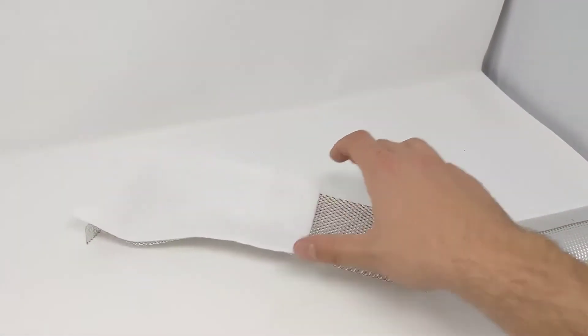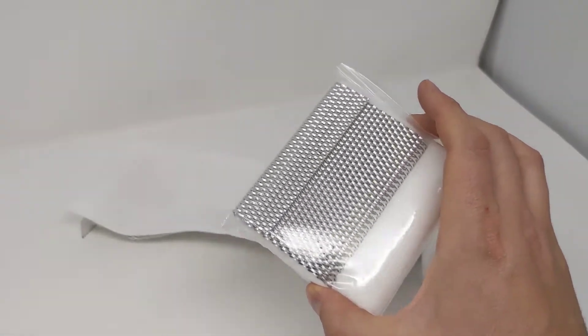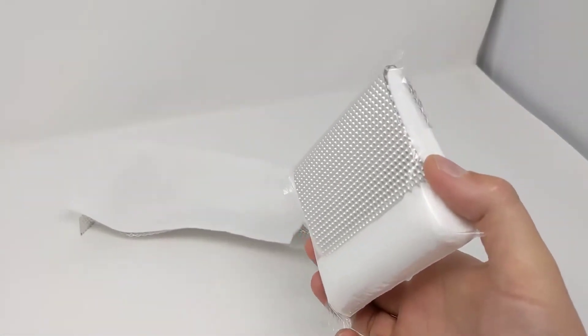This is a nice little addition that you can just throw in a backpack, take on a hiking trip, or add to your first aid kit — just to have a nice compact splinting option with you.